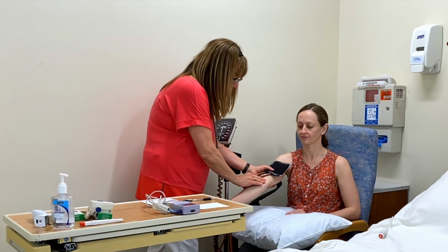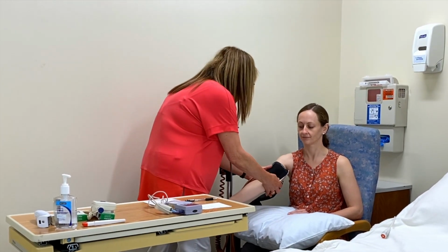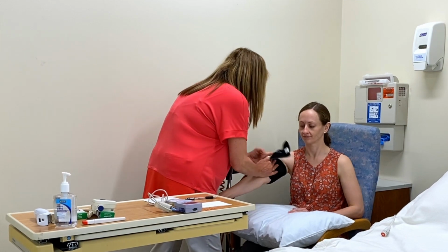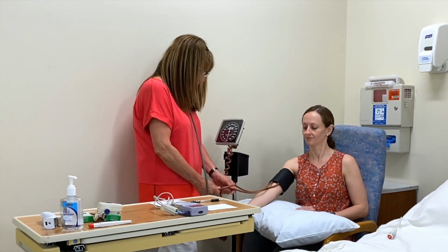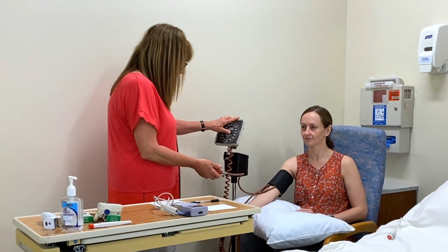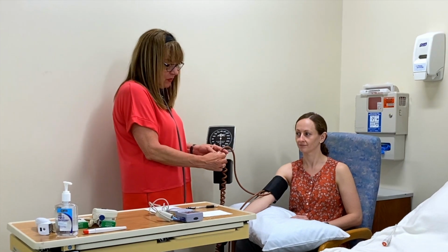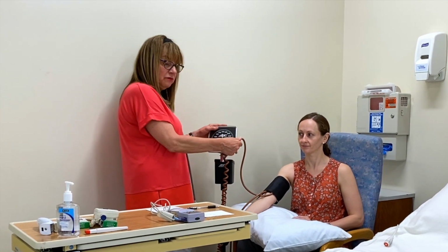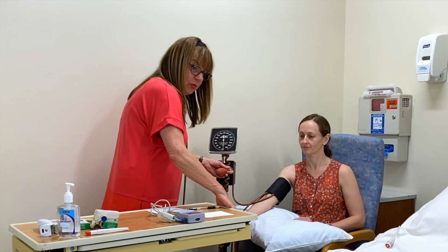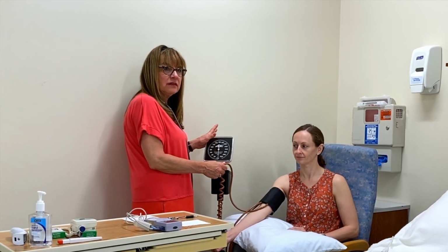The brachial artery is right here, right there on her. So I'm going to put it a couple of inches above. Make sure it's secure. Make sure it's not too big or too small. This is the sphygmomanometer, okay? And it has a valve on it. So you have to get used to just kind of releasing the valve appropriately, okay? So that it's not too fast or too slow.